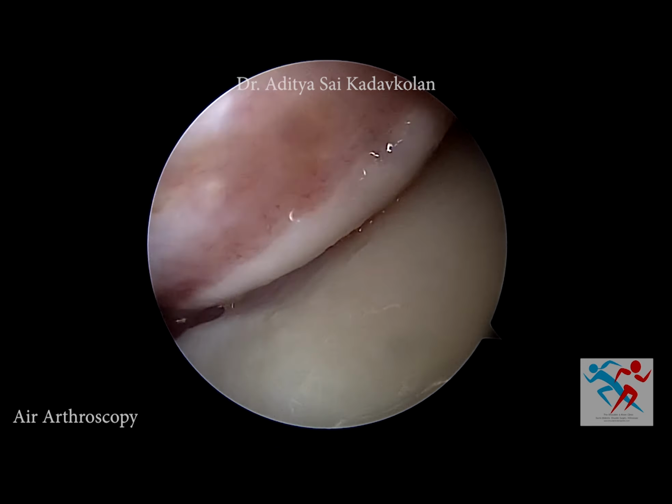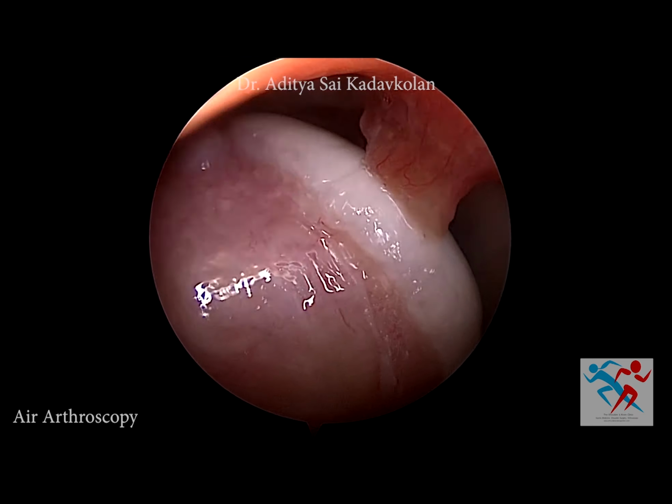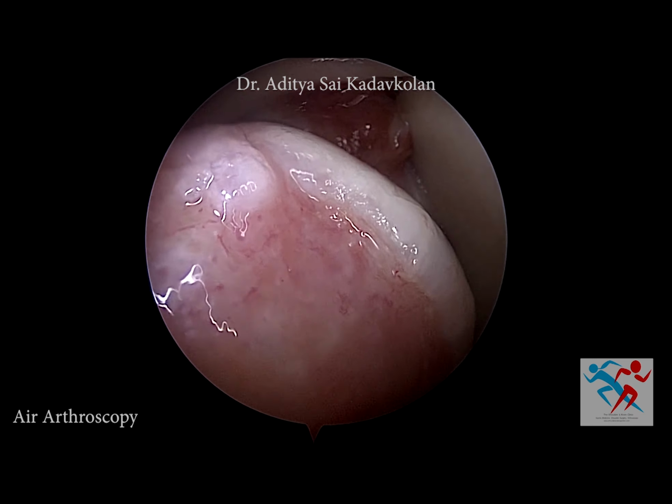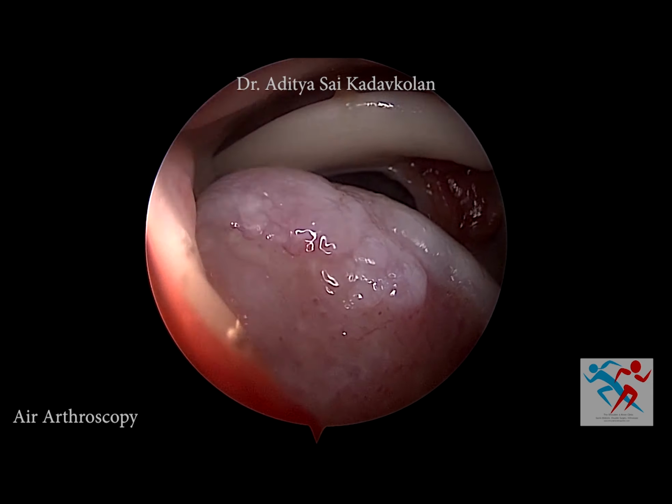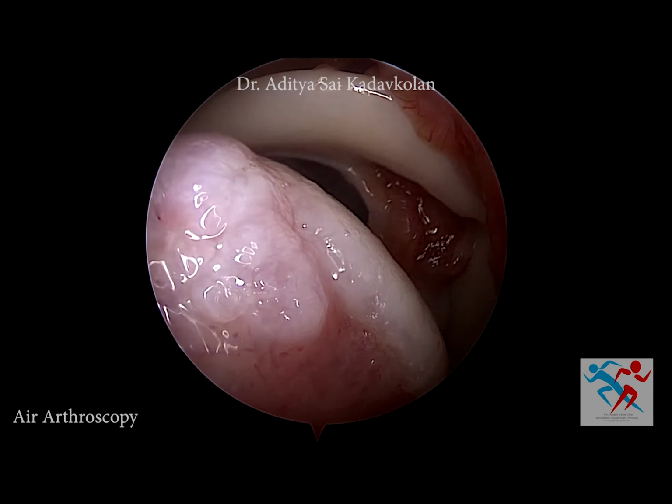There is a defect which we can see on the back side of the ball. That's what we call a Hill-Sachs lesion. Again, this is the Hill-Sachs lesion which you can appreciate. There is the biceps tendon on the top at about 1 o'clock position.